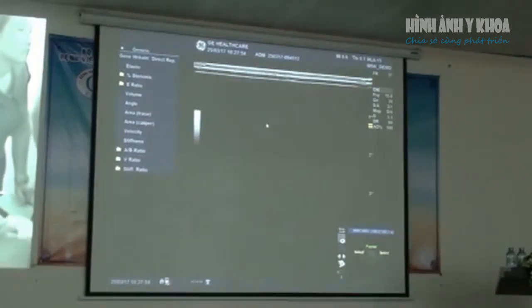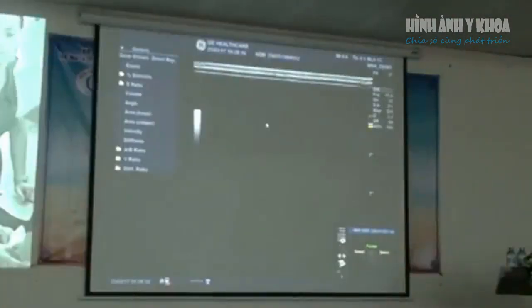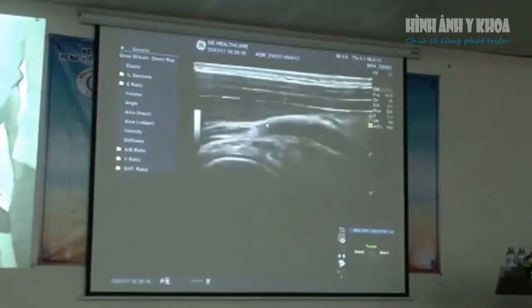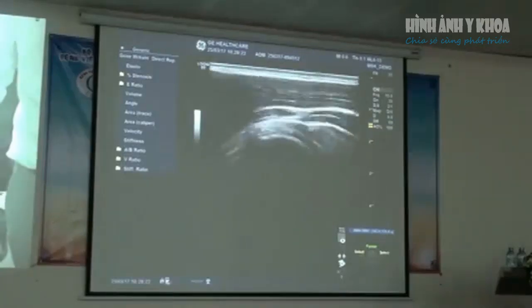Please do the scan of the axillary bulge on the ultrasound, to scan the inferior glenohumeral. So, to look at the inferior glenohumeral ligament, you just ask the patient to go into that stop sign, raise the arm up. And then you're just coming in from anteriorly.